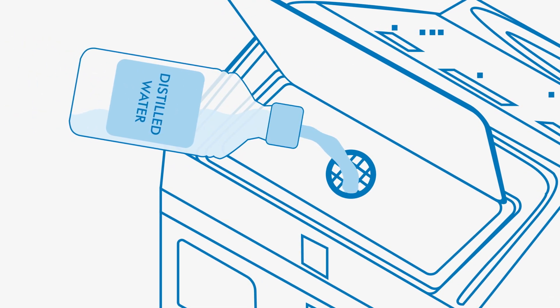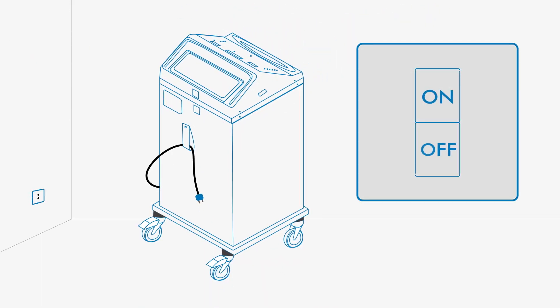Check the level of distilled water in the reservoir. Top off as needed until water is visible just below the plastic grate. Insert the power cord into a properly grounded hospital outlet.